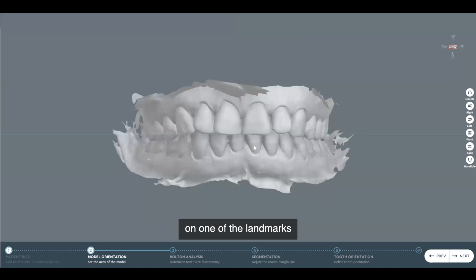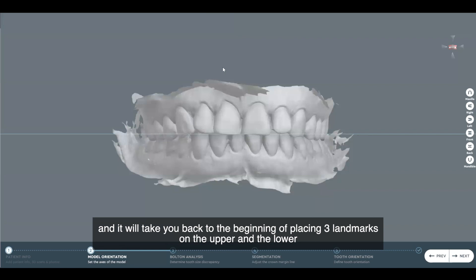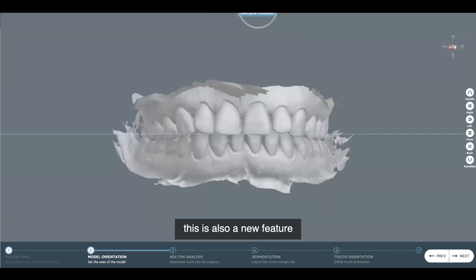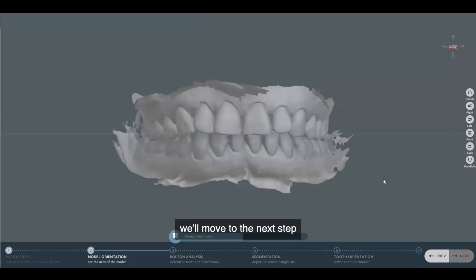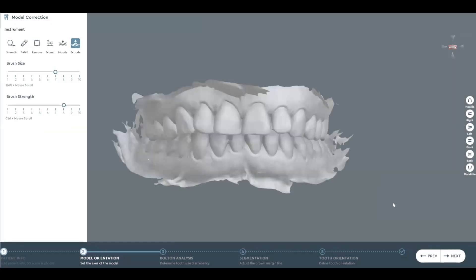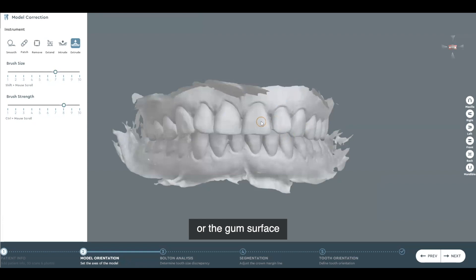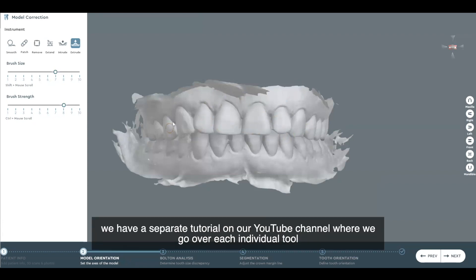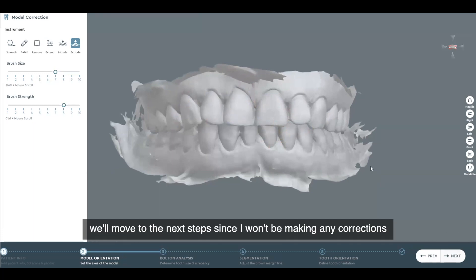If you decide that you made a mistake on one of the landmarks or want to redo it, you can use the icon called the three-point orientation, and it'll take you back to the beginning of placing three landmarks on the upper and then on the lower. This is also a new feature in our latest update, so if you'd like to try it, just let us know. We'll move to the next step. This is our model correction or sculpting scene, where we'll be able to use any of the tools to make adjustments to the surface of the tissue or the gum surface. We have a separate tutorial on our YouTube channel where we go over each individual tool.